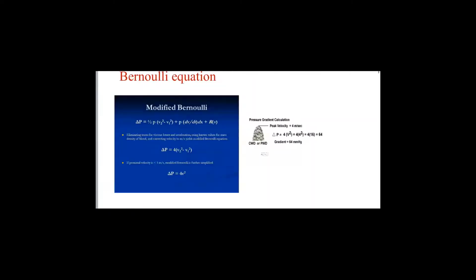Now, what is the Bernoulli equation? Bernoulli equation is the second most important equation in echo. And I think you should all be familiar with it because it's integrated into the calculation of gradients from velocities. So it basically converts velocity into gradient.